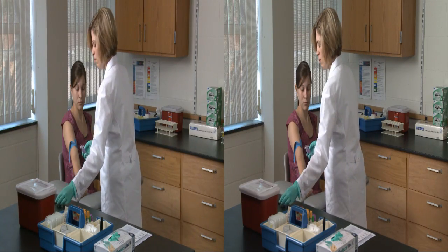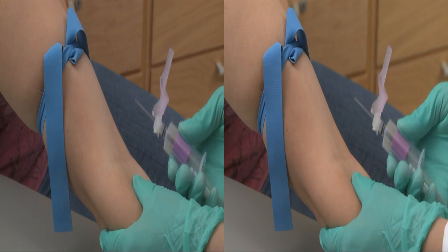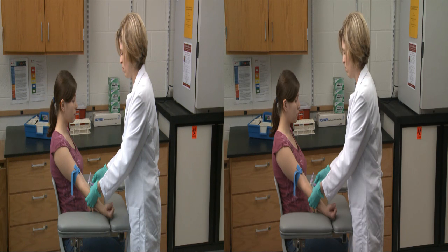Grasp the patient's arm firmly with your hand, placing your thumb approximately two inches below the intended puncture site. With your thumb, pull the skin taut over the vein to help anchor it in place. Then let the patient know you're ready to make the puncture so the patient won't startle and jump. You'll feel a slight pinch.